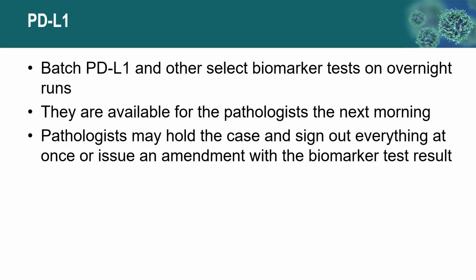And we also have a very active dermatopathology laboratory that sends us all their histology. And so we had to find space. We have limited space at our institution, and we had to figure out how to turn around our IHC so that we can get our diagnoses out the door, but also perform biomarker testing. So the solution that we found was that we would batch PD-L1s and some other select biomarker tests on overnight runs, so that they would be available to the pathologist the next morning.